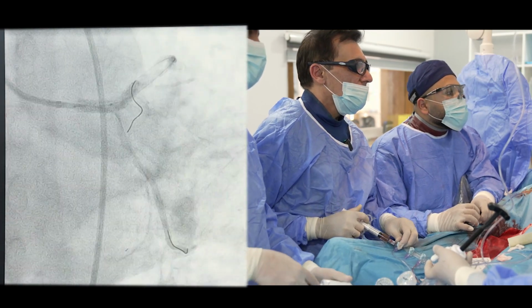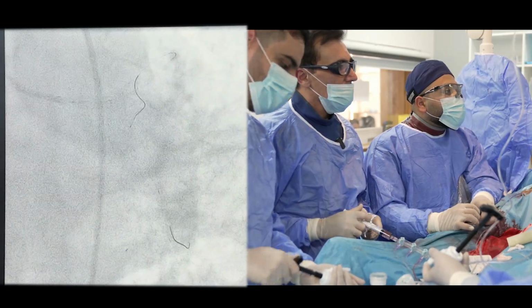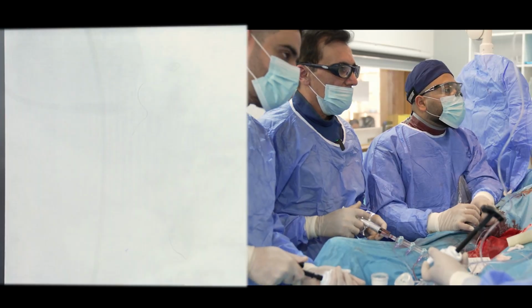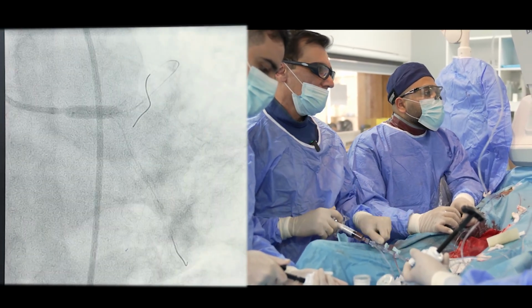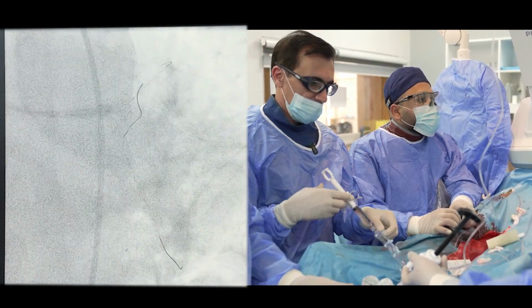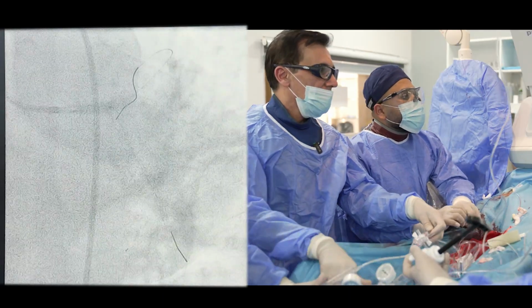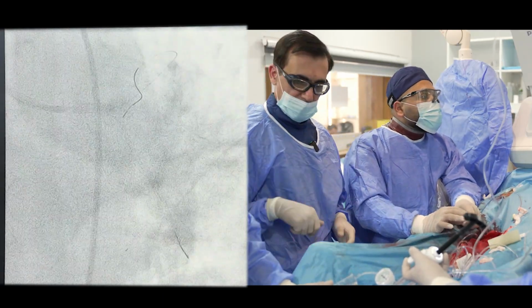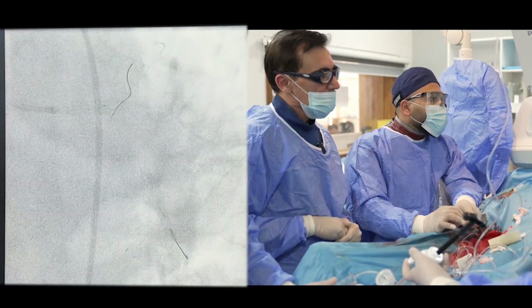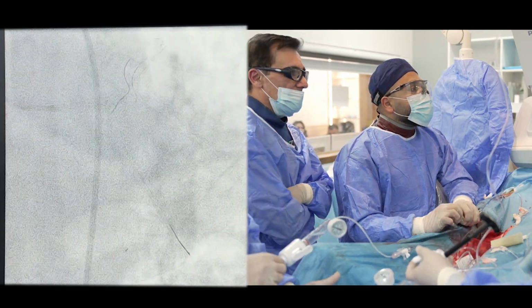Yeah, that's good. Okay, go to 16. Fluoro. 16. Off. Pressure. Yeah. Off. Deflate. Yeah, okay. Now take out everything.